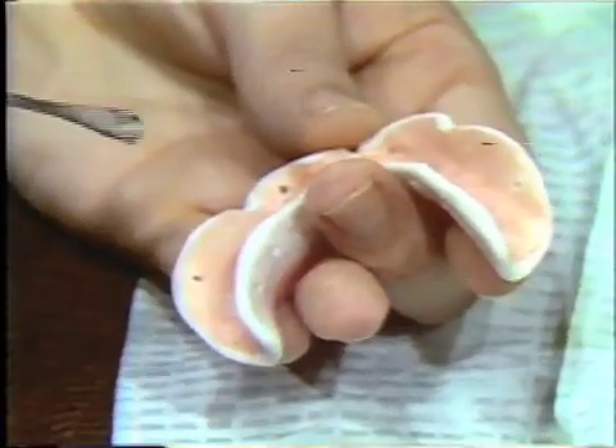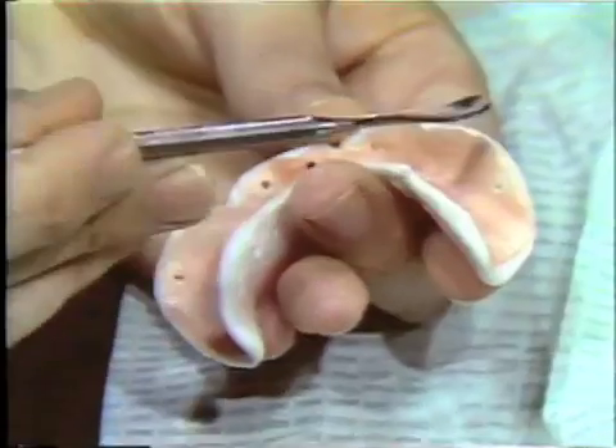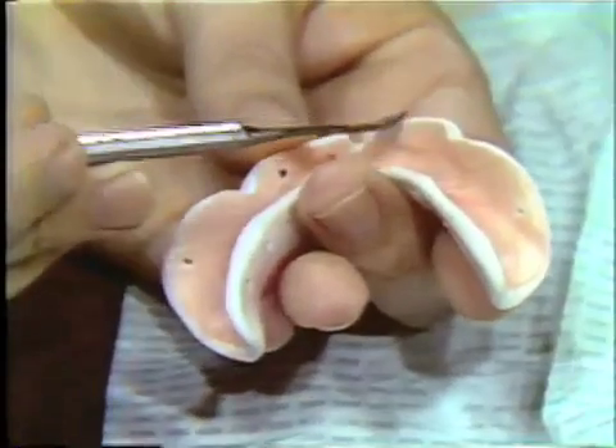There are also some things I'd like to indicate in looking at the tray: we have the lingual extension, the buccal extension, and the labial extension.